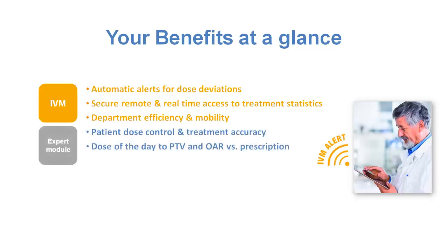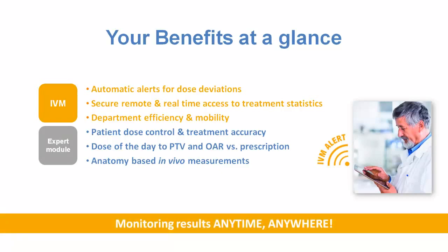the reconstruction of the dose of the day to PTV and OAR compared to the prescription dose, and anatomy-based in vivo measurements. So, anytime and anywhere within your hospital network, you will be able to track dose monitoring results for every patient, every fraction.